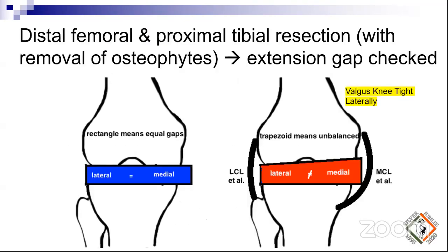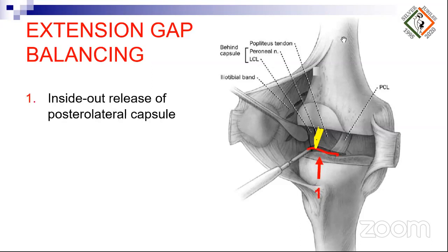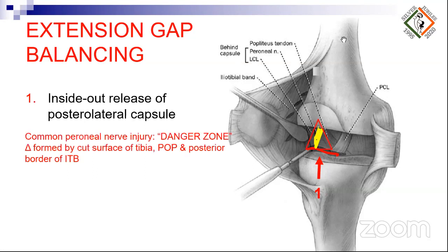Basically, after the distal femoral resection and proximal tibial resection, in a valgus knee, you'll have the tight structures laterally, and obviously you'll have a trapezoidal or unbalanced knee. The way this is done is by doing an inside-out release of the posterolateral capsule. This is the video that was very aptly demonstrated by Anup in his talk, which was supposed to follow mine, but unfortunately, as I said, he had to come before me. During this time, it's important to remember that where we're doing this release, you've actually got the common peroneal nerve.